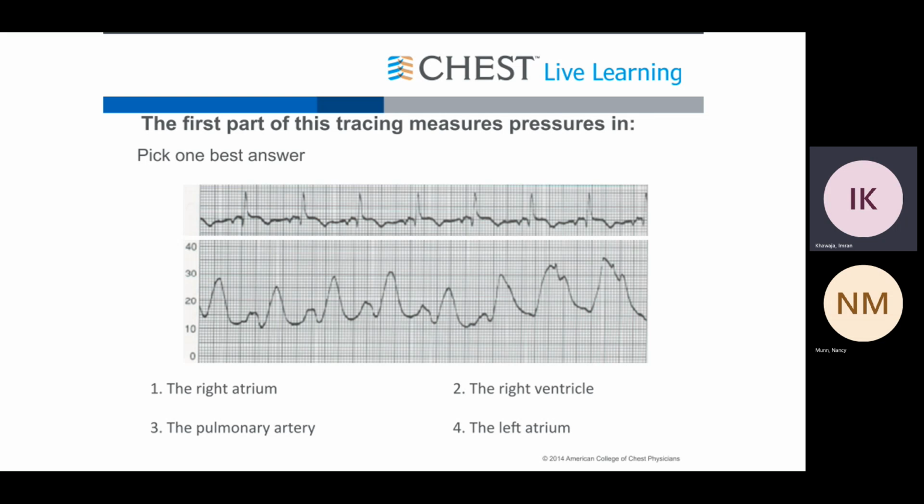The first part of this tracing measures pressure in... We did another question in the opposite way, right? So think about it in the opposite way. The question is somewhat tricky. So that's the PA, and then, okay, on the left side, what do you see here? Let's start on the right side. What do you see on the right side? Look at the diagram. So that's the PA, right?